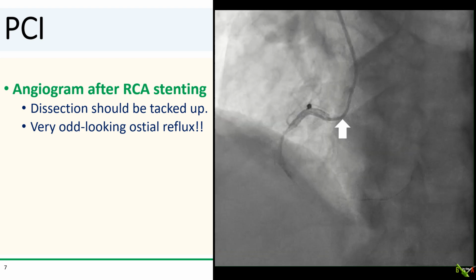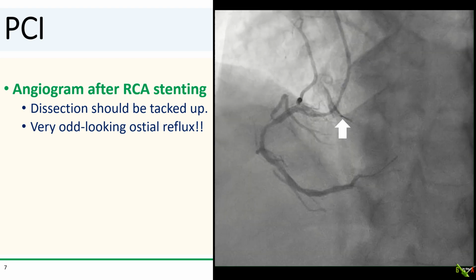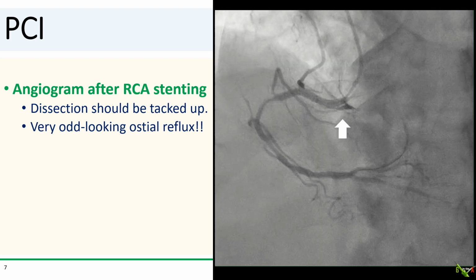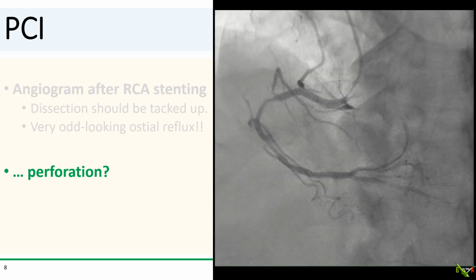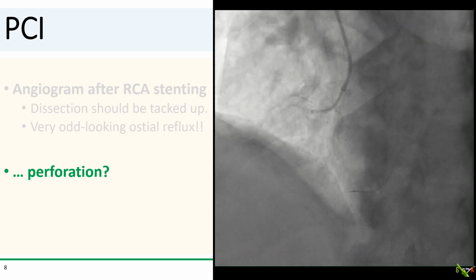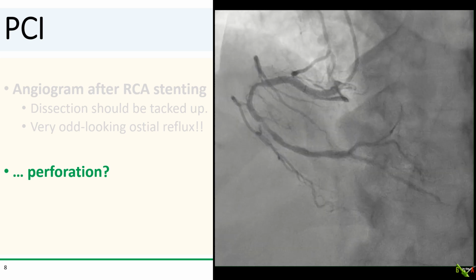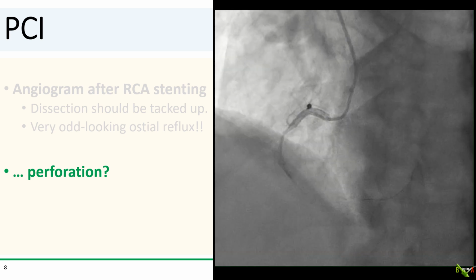But notice that there is a very odd looking contrast reflux at the ostium of the RCA. It almost has an appearance of a perforation, but where was all that contrast going to? It doesn't look like it's going to the pericardium, and it certainly doesn't seem to be filling the lumen of the aorta like normal.